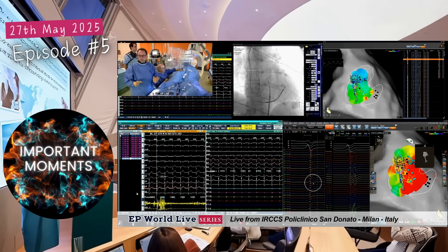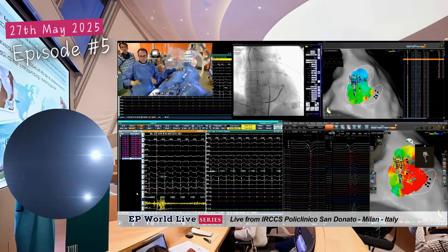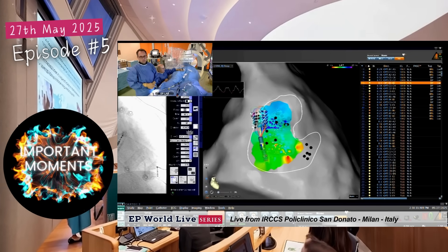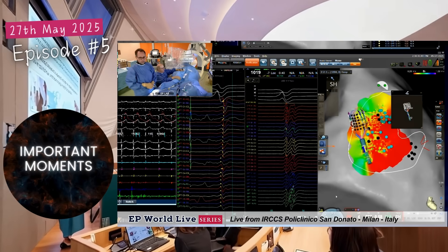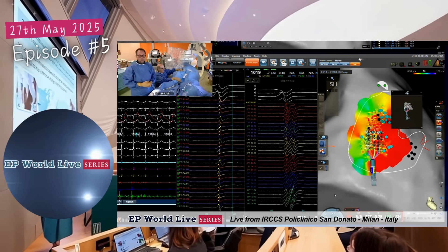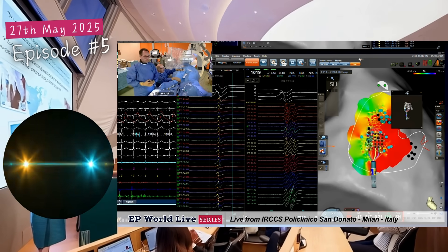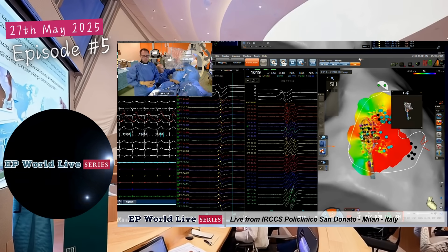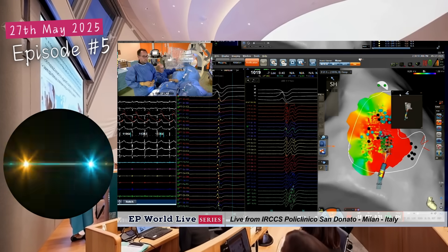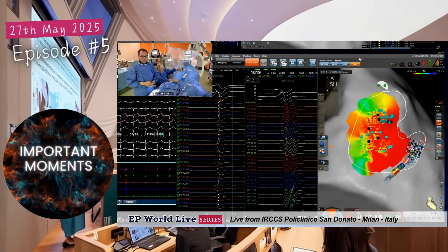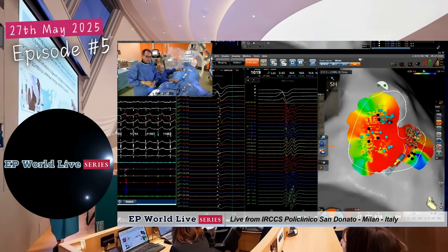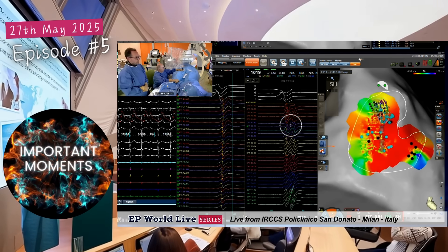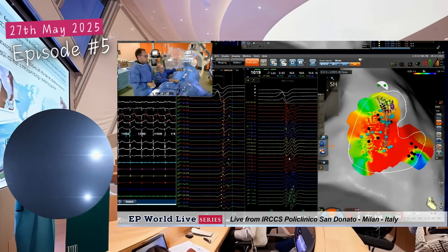You see 'after' on the left. Alessandro, zoom on the carto signals, bottom panel right. So here you are looking at the carto screen — after, you see very homogeneous signals. Before, there were double potentials. On the left panel you see the live screen and the live signals, nicely indicated with the blinking arrow of the carto. Whereas on the right side you have in the same area the double activity which has been nicely homogenized.